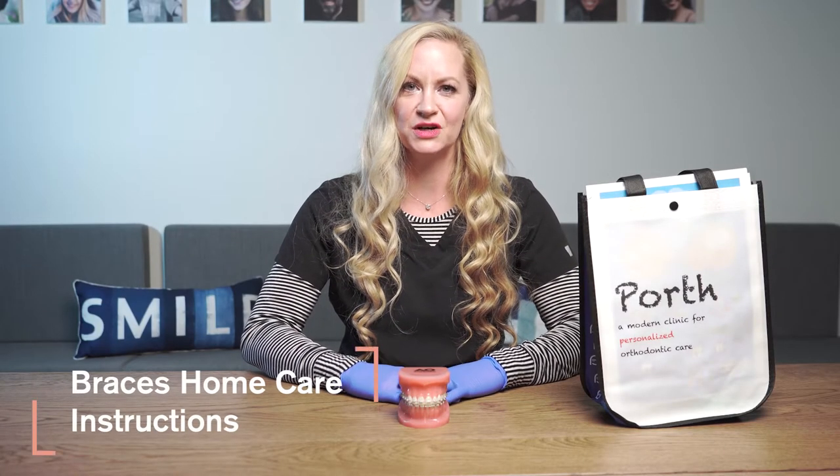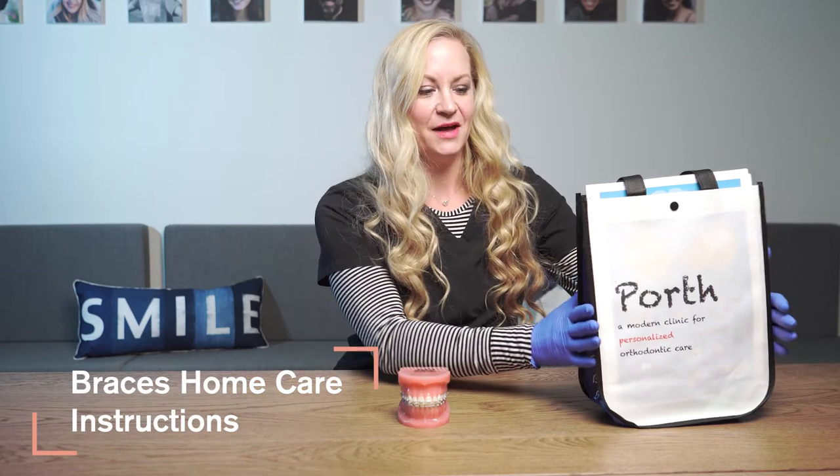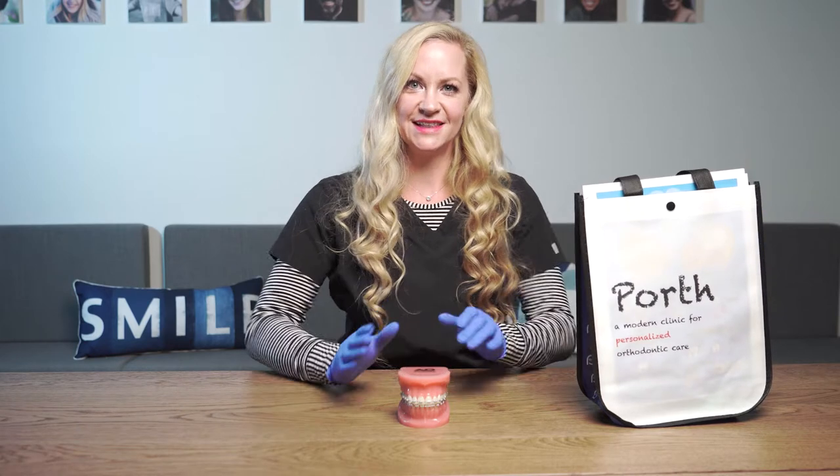Hi, my name is Rachel and I'm going to walk you through home care instructions for your braces. We will provide you a bag with everything you need to keep your teeth nice and clean.